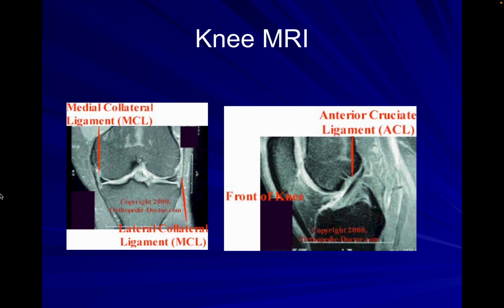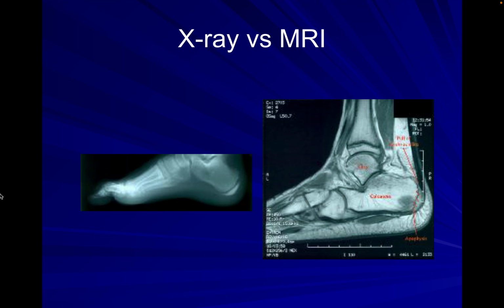And on the right there, that thick black line from the anterior tibia to the posterior femur, representing the anterior cruciate ligament. And you can see how there's a fair amount of detail there, and if there was a discontinuity in that solid black line, you might be concerned about things like an ACL tear or whatever ligament it may be demonstrating.